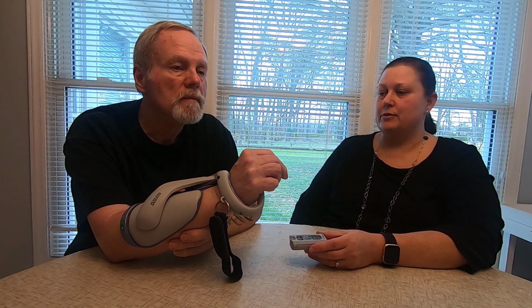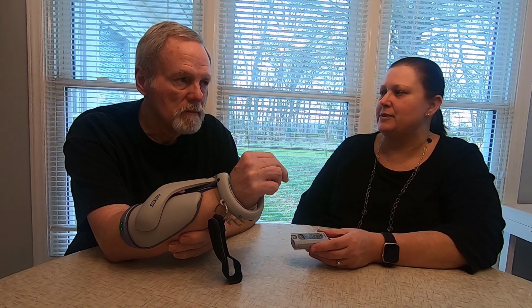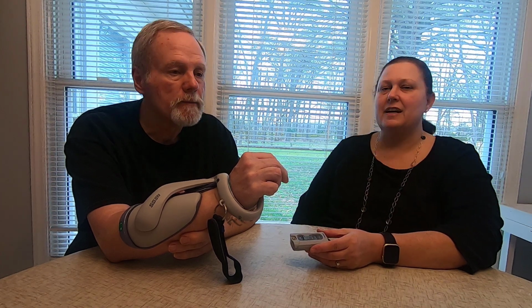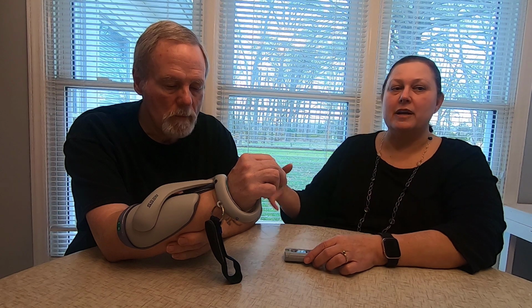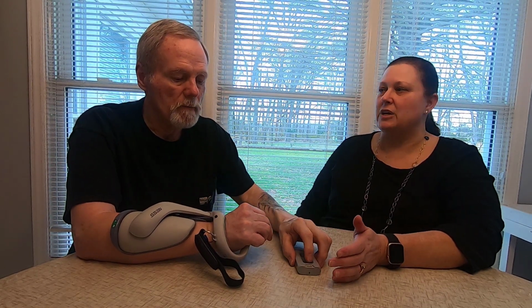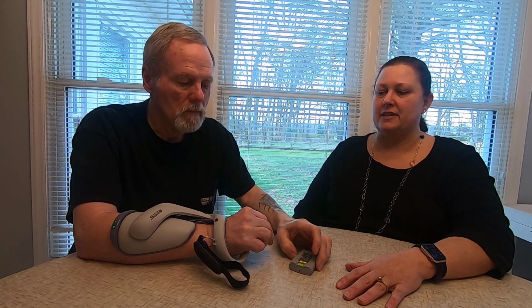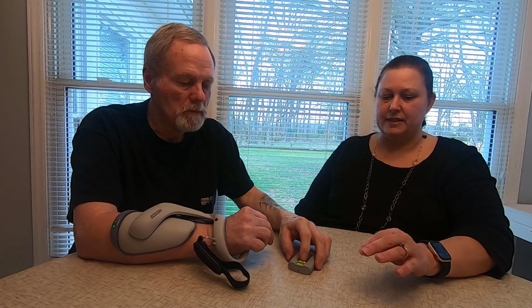Again, you start out using it for a shorter period of time. I think when he started, didn't she have you only use it even 10 minutes a day? 10 minutes a day. Yeah, because when this thing is working your muscles, it's like you're exercising. It exhausts you. It can make you tired just from using it. That's what the therapist explained that helped fit him for the device.